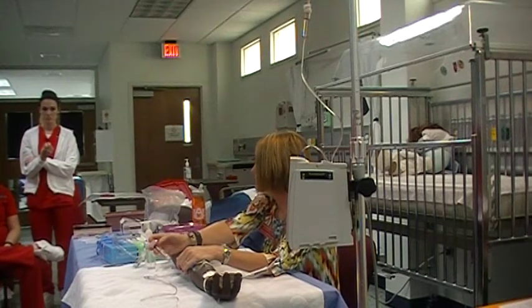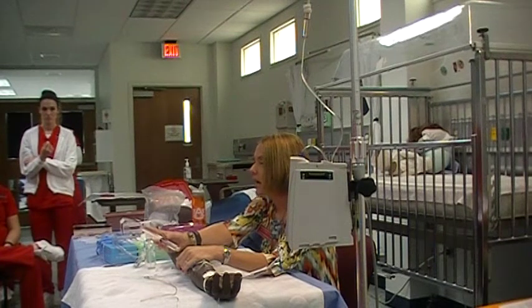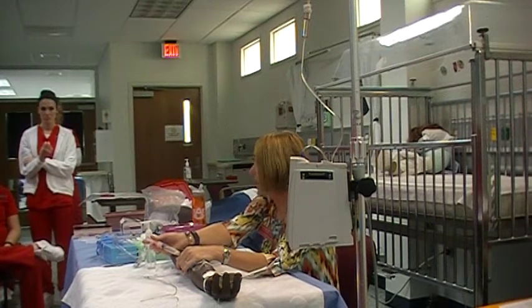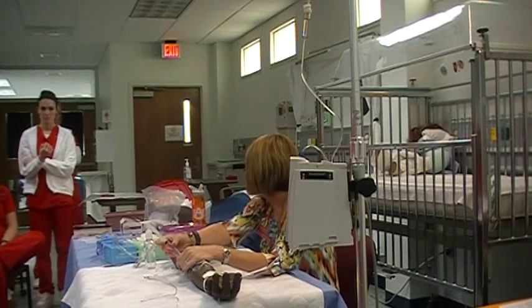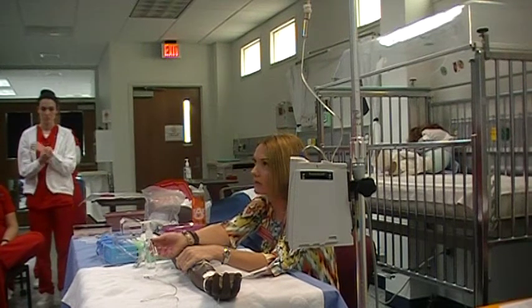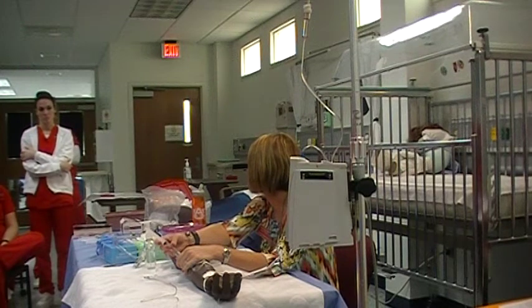This is where you guys mess up. Flush at the same speed. Okay? Don't give your morphine beautifully and then you flush and you just hit it as fast as you can. It's happened at the bedside with a patient. Wouldn't that push all the drugs that are left in the line in too fast? Right. That's why you have to do it at the same speed as your medication, because that's when the patient feels that euphoric feeling if you're giving a morphine type dose. And with a little old lady who's 90 years old, you've just put her in respiratory compromise potentially.